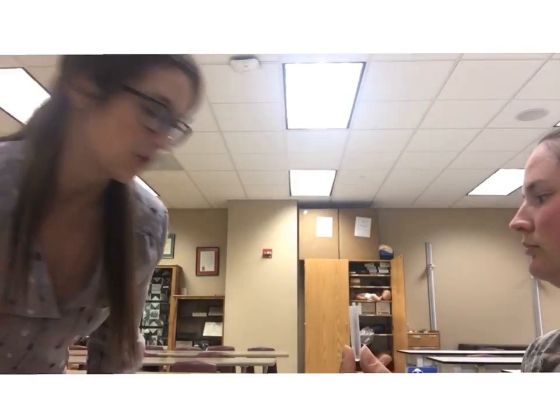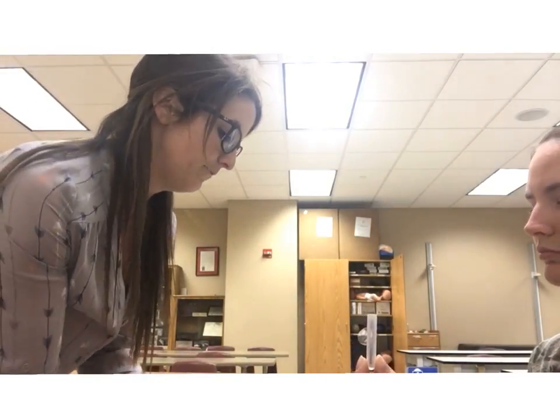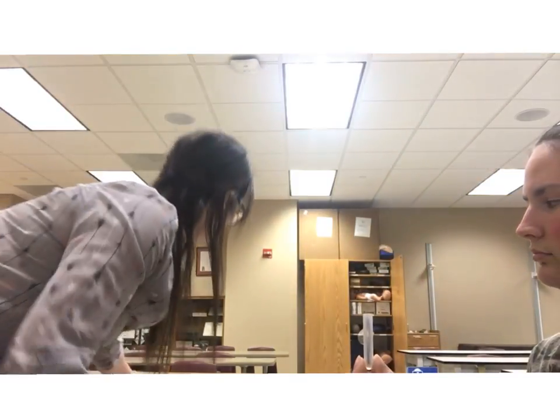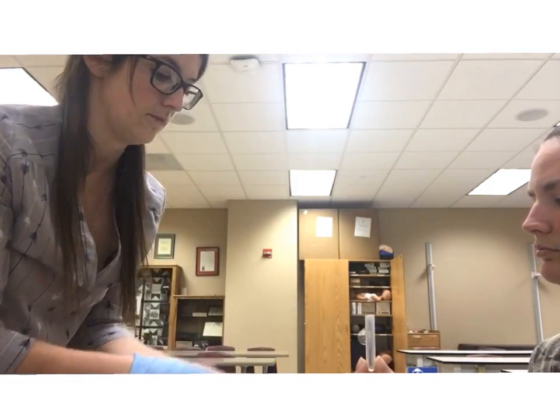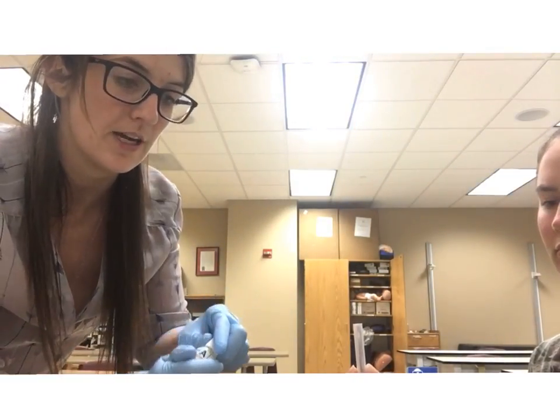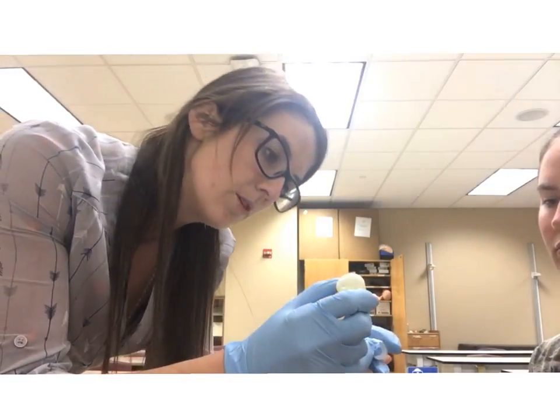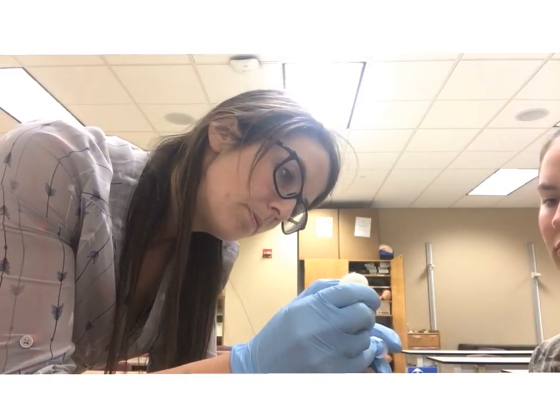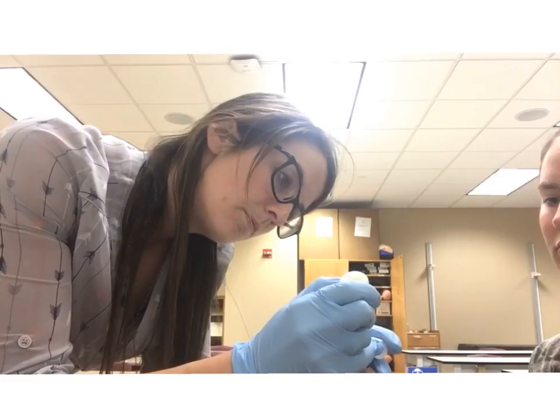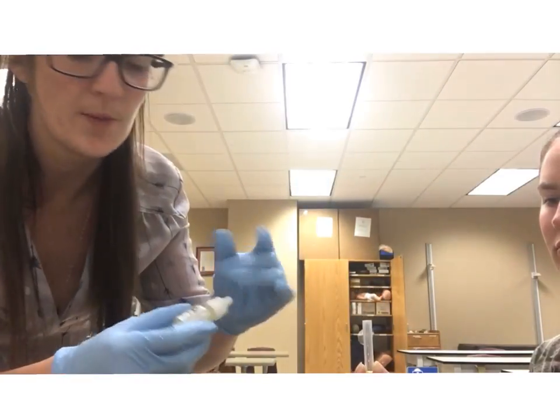It's really important that you put gloves on because you will be handling saliva. Next, we're going to put four drops of reagent A into the test tube, and then four drops of reagent B.